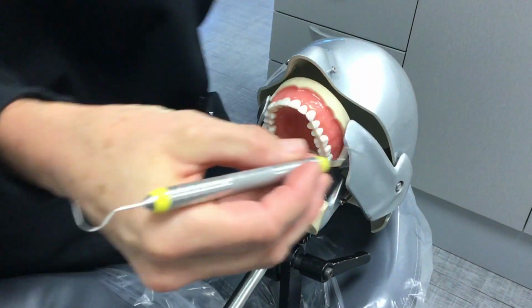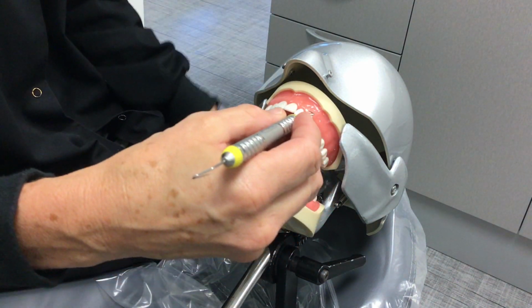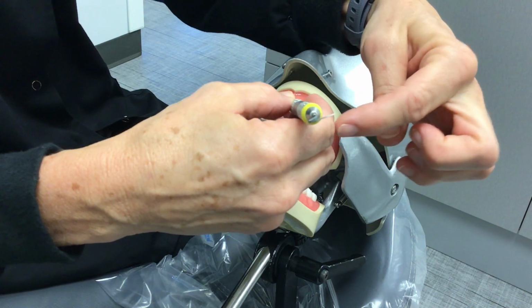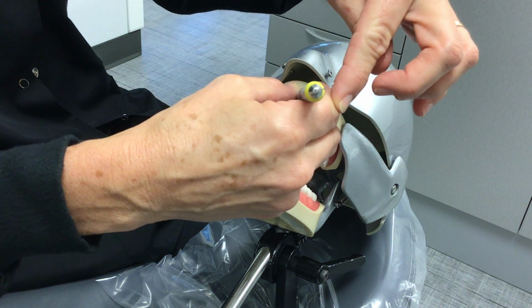What you would do next is hold your instrument in a modified pen grasp, and what we'd like to see you do is take your instrument and pull it up right behind this knuckle. That will allow you to stand up on your fulcrum in order to reach where you need to reach.